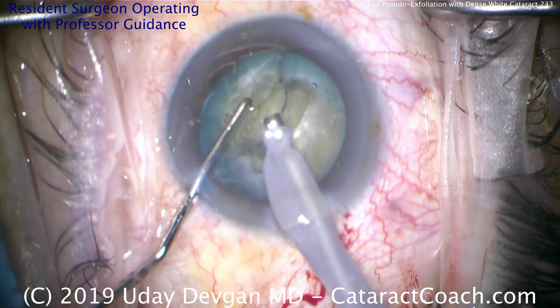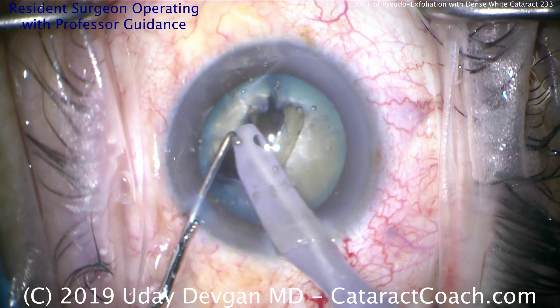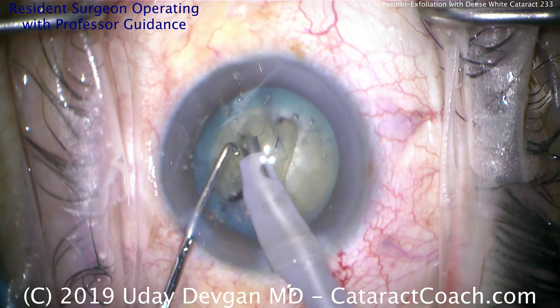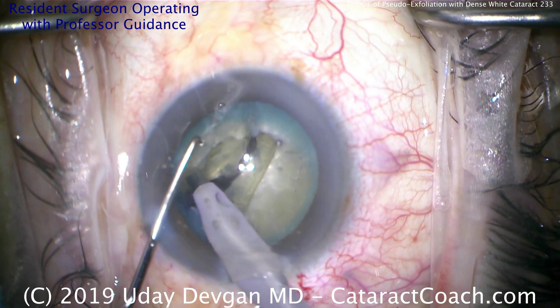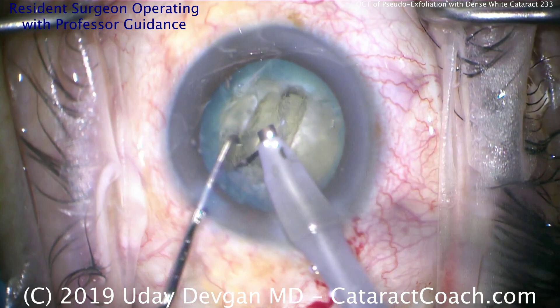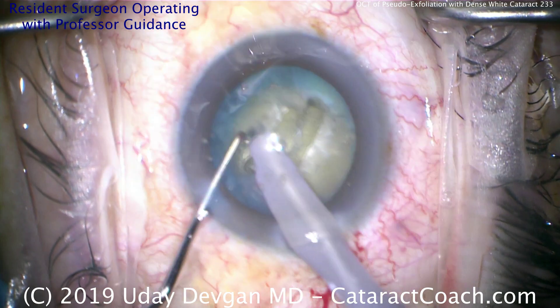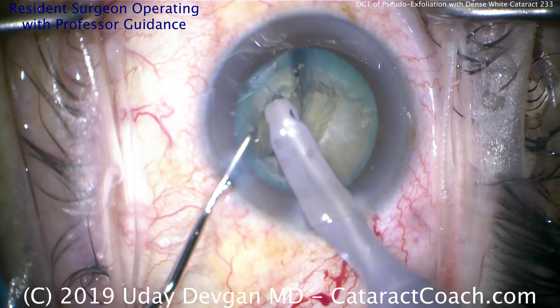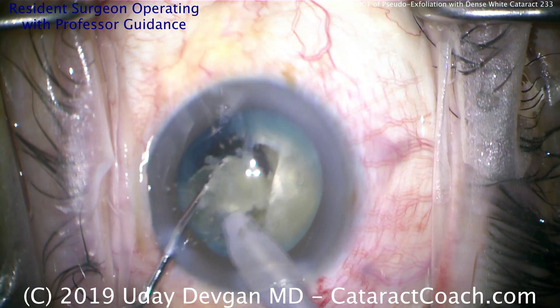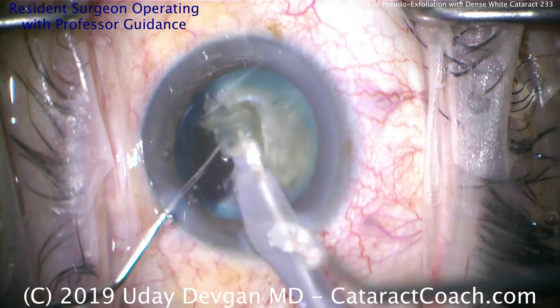I like the idea of going after the smaller of the two pieces. Buzz in with the phaco probe on a high vacuum level — at least 400 millimeters of mercury. Buzz into that piece, bring it up, get the chopper around the equator. Try again — buzz in again and see if we can get this piece up into the iris plane. Use the high vacuum level to hold the piece, bring the right hand towards you to bring the piece out of the capsule bag, then get the chopper around it. Keep the piece at the iris plane using the chopper to hold it, and apply the phaco energy to ultrasound-aspirate it. So that was a good job.